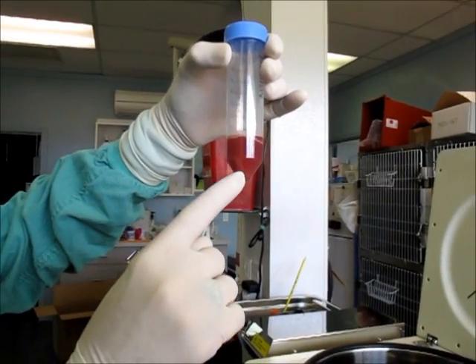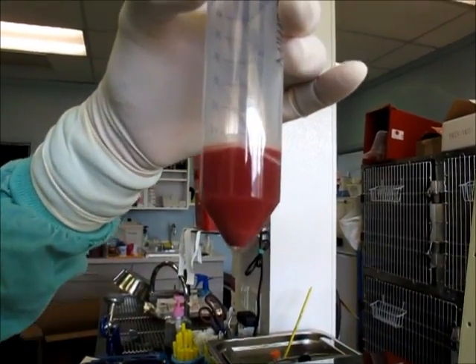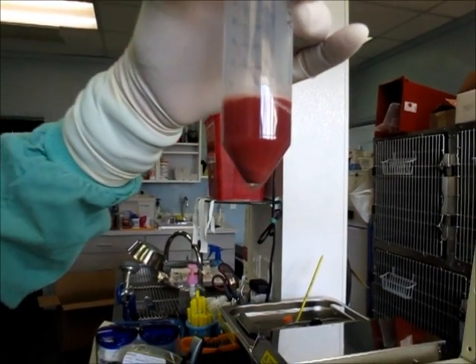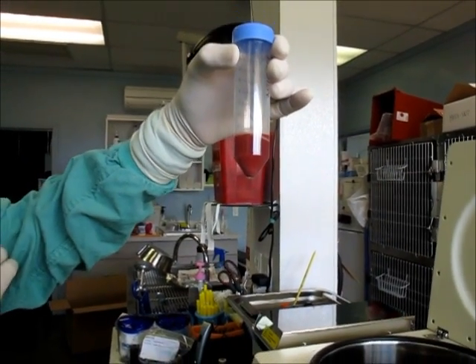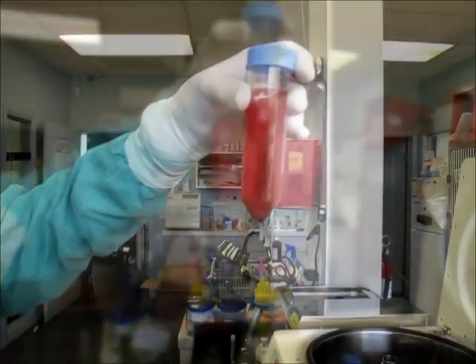After the spin, you can see a cell pellet at the bottom. I'm just going to take a picture.